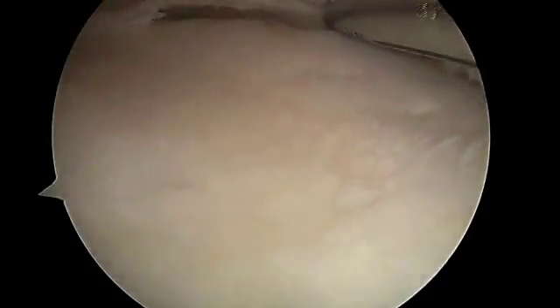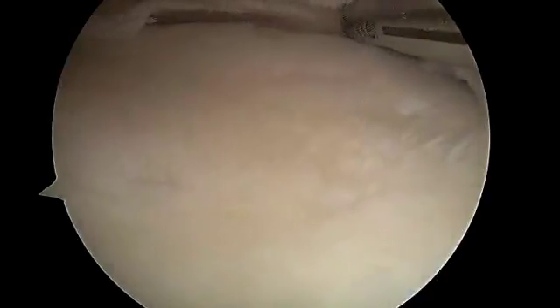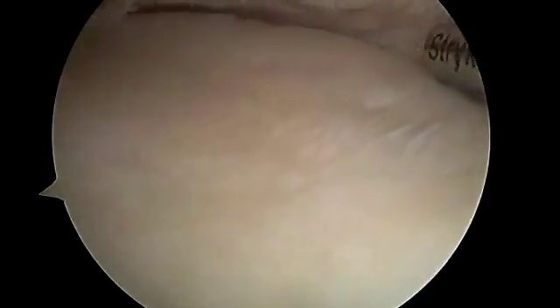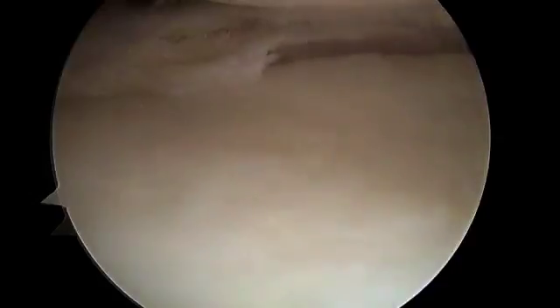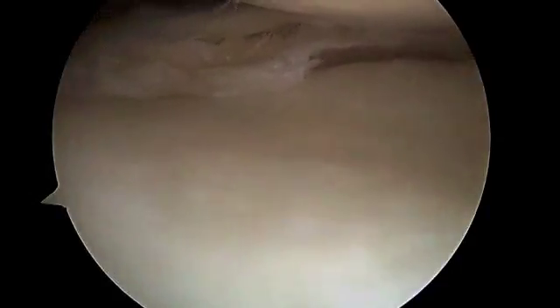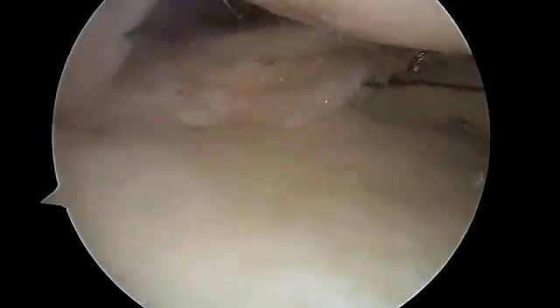There's a little bit of damage on the tibial plateau, but in general the tibia side — the bottom side of the knee — looks fairly good. Articular cartilage is well maintained. We're using these motorized instruments to try to resect just as much of the torn meniscus as necessary to stabilize it and prevent the symptoms of pain and swelling. Here is a meniscal punch.